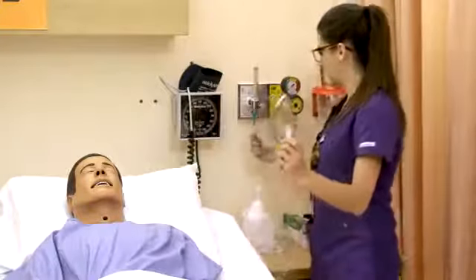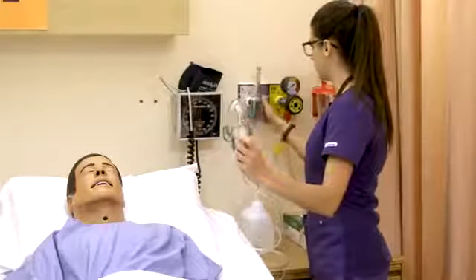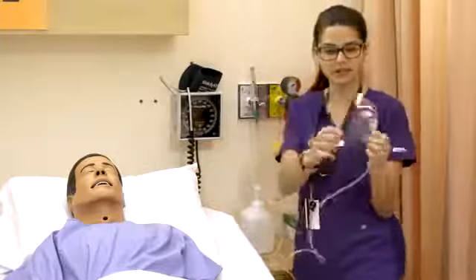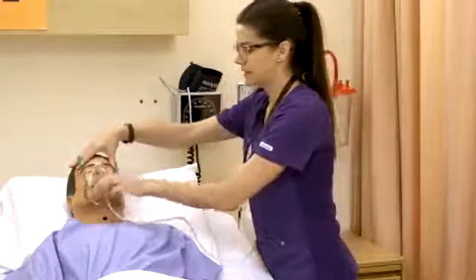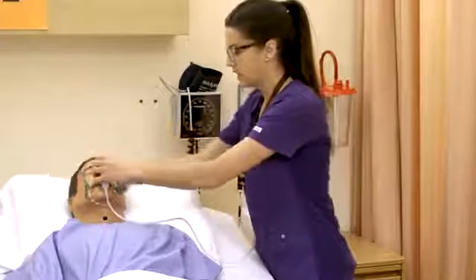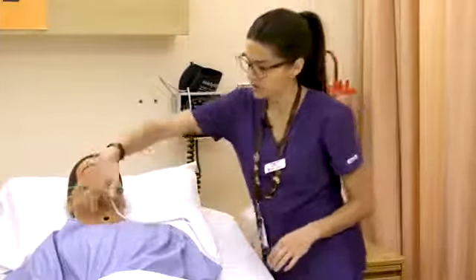And then same as with the nasal prongs, we're going to hook it up to the adapter of our flow meter and turn on our flow meter. So again, this would be anywhere from 6 to 10 liters, which a simple face mask is good for. Then you're going to affix it to the person's face with the nose piece over the bridge of their nose and the strap behind their head. And you can pinch it to make sure you get a good seal.